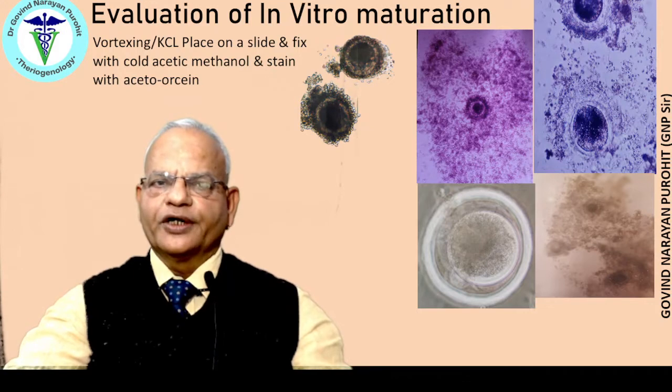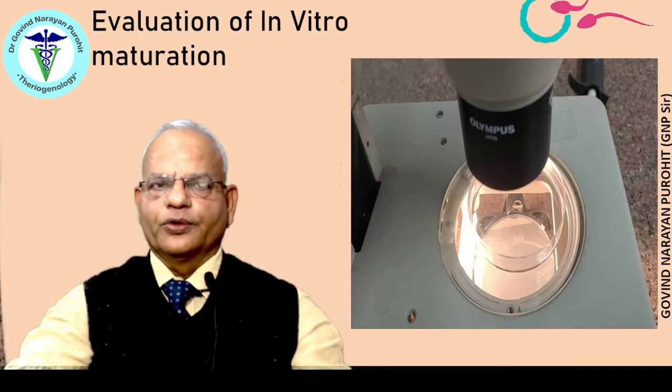Now the denuded oocytes are placed on a slide, fixed in cold acetic methanol and stained with aceto-orcein.